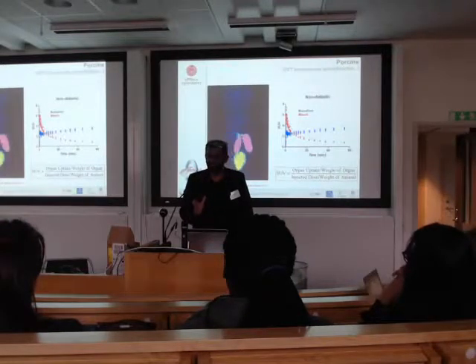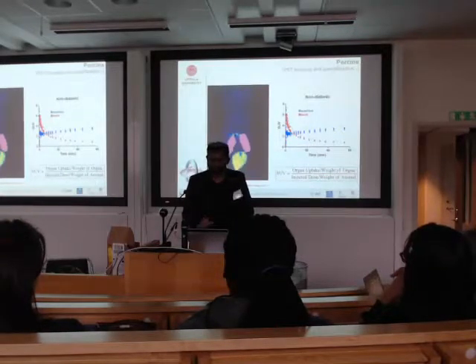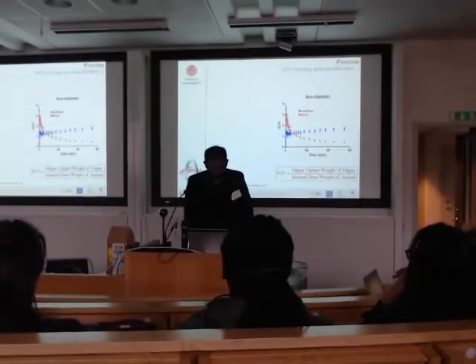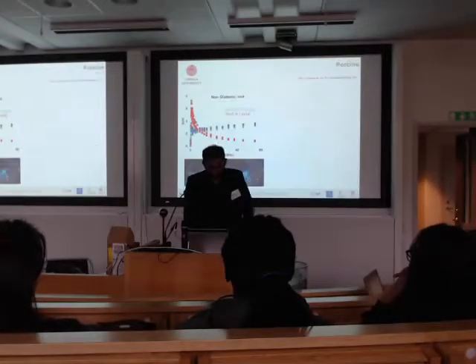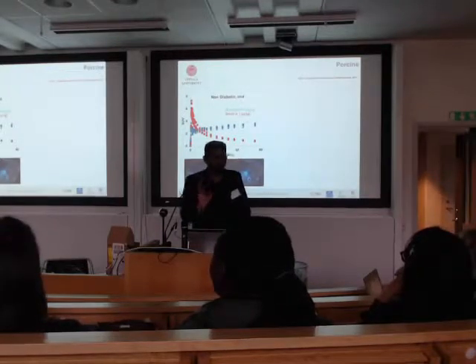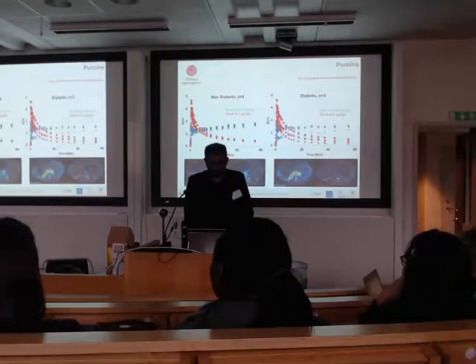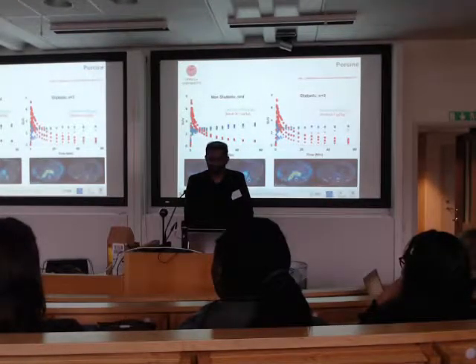We did a baseline scan, which is mostly tracer, no competition. After that, we did a competition study, and you could see we were able to block it. Happy. Next, baseline and block studies. Okay, so this is the profile from the non-diabetic animal. We could see a specific uptake of the tracer in the pancreas. Bingo. Now we did it on a diabetic animal.